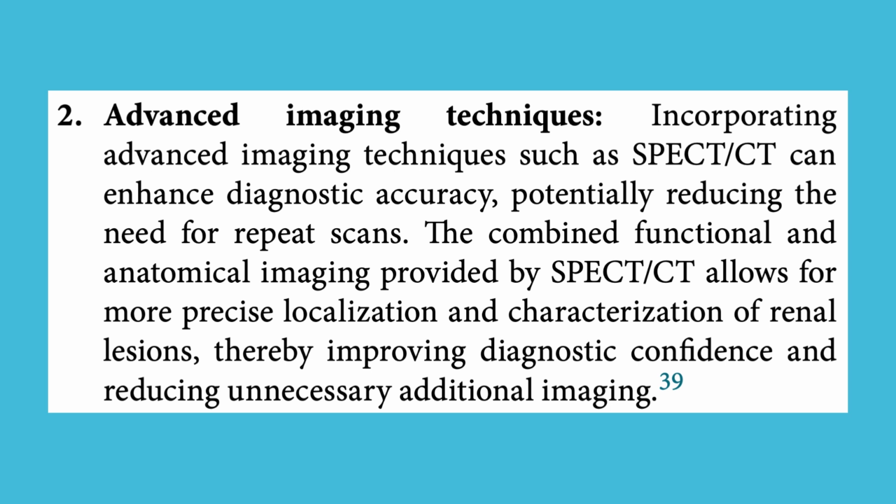2. Advanced imaging techniques. Incorporating advanced imaging techniques such as SPECT/CT can enhance diagnostic accuracy, potentially reducing the need for repeat scans. The combined functional and anatomical imaging provided by SPECT/CT allows for more precise localization and characterization of renal lesions, thereby improving diagnostic confidence and reducing unnecessary additional imaging.